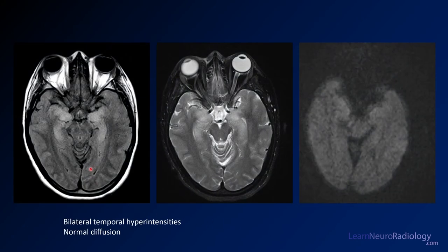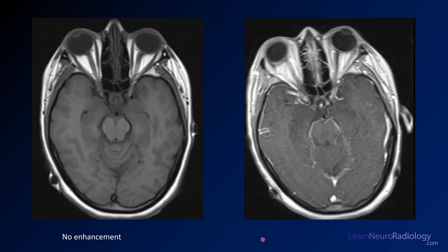To review these imaging findings: there are bilateral temporal hyperintensities on FLAIR, normal diffusion, just a little bit swollen and a little bit too bright, with really no enhancement.